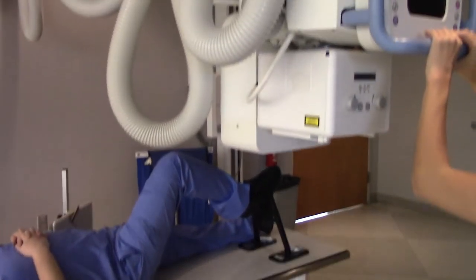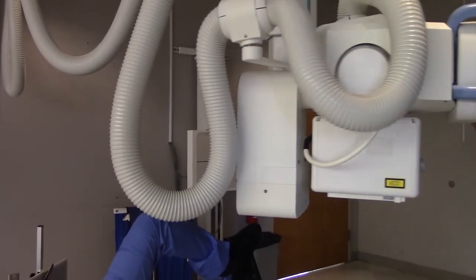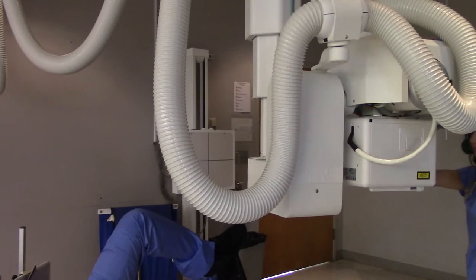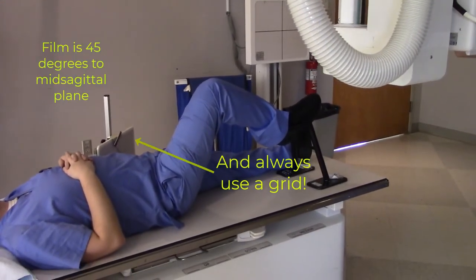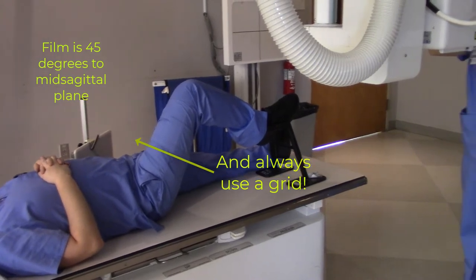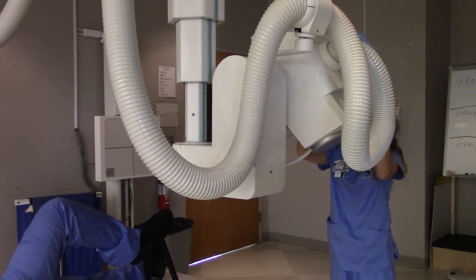Don't worry, I'm going to... People are watching you. No, they're not. I'm not going to get your head on here. I'm just going to get your hands and your patient. That's our seat. She's a little... What the hell?